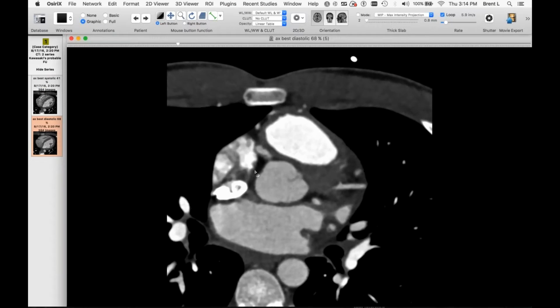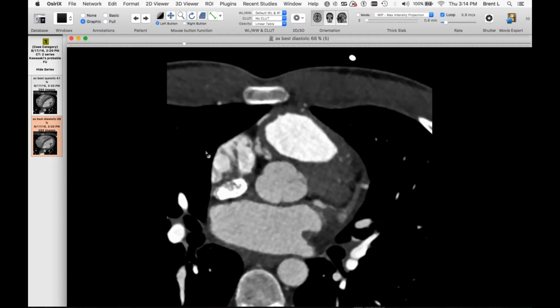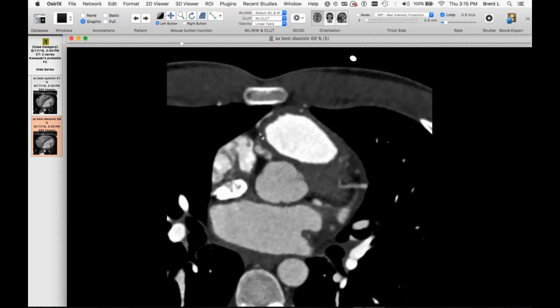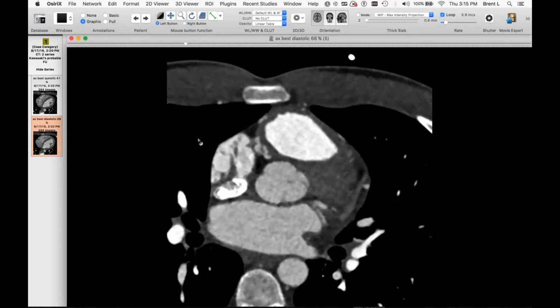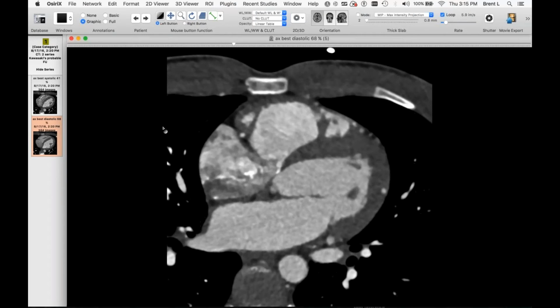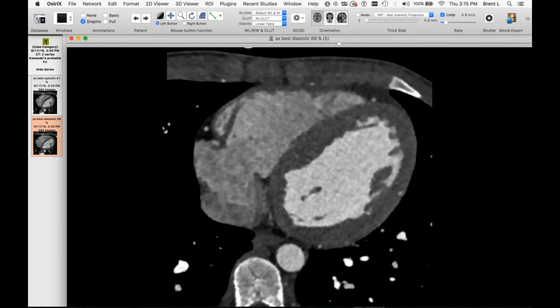This is a coronary CT that we did. First thing you can see is the RCA here, and you can see this abnormality of the RCA, a very strange abnormal proximal RCA. I'll point out that the conus branch here is pretty dilated. You can see it coming across here, so that's abnormal. Then following the RCA on down, you can see some alternating areas of enlargement and narrowing of the RCA, and we're going to come across down here.